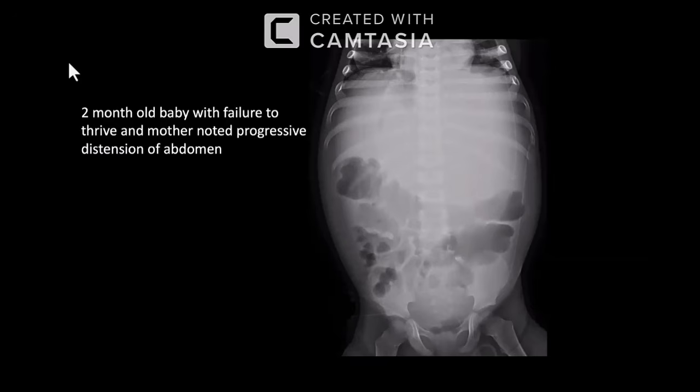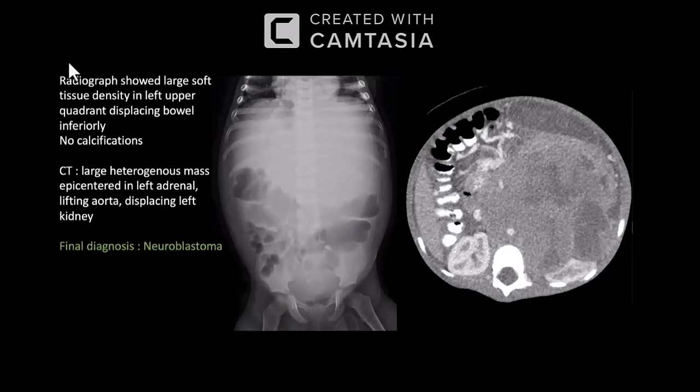I would convey my findings to the parent physician and ask for further characterization of this lesion by ultrasound of the abdomen. And if there's any suspicion about this lesion, I would proceed further with a CT. Okay. So let me just take over.